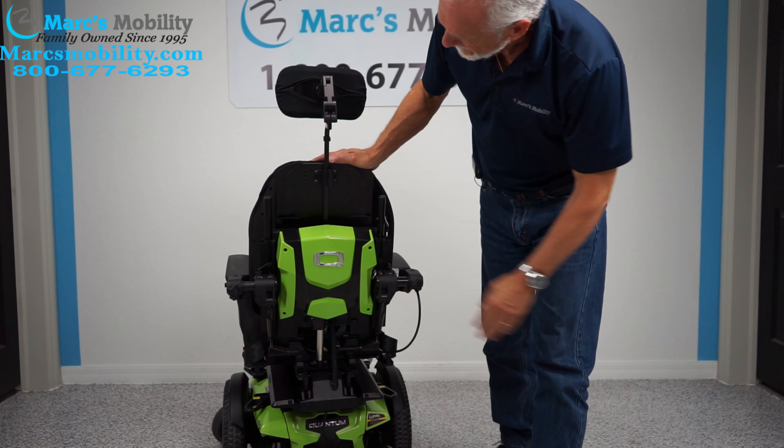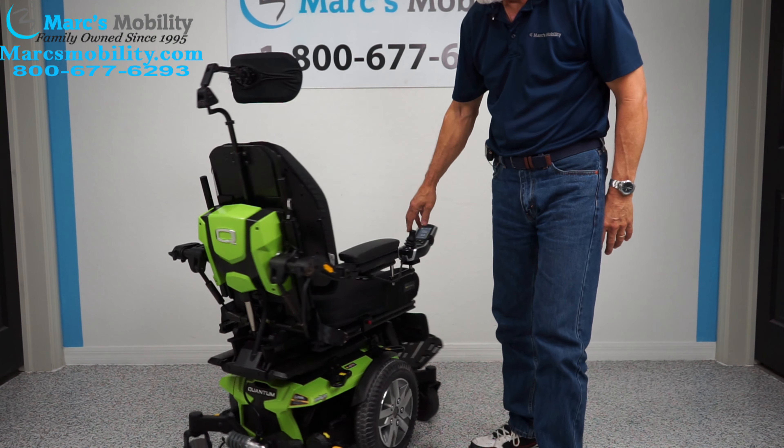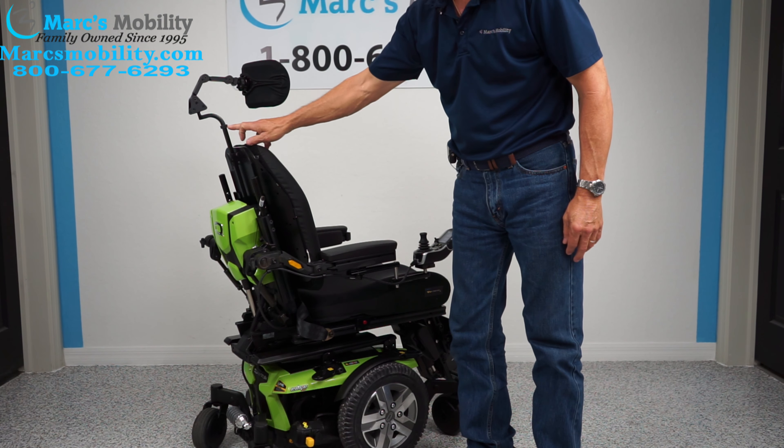Look at the back of the chair — here we have a fully adjustable headrest. You can see all the adjustments right here for the headrest, all adjustable.